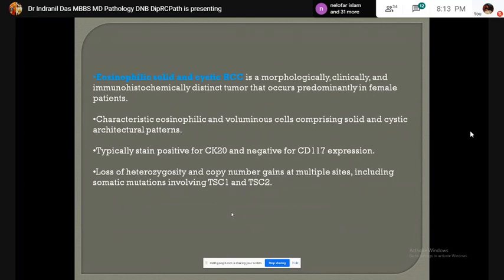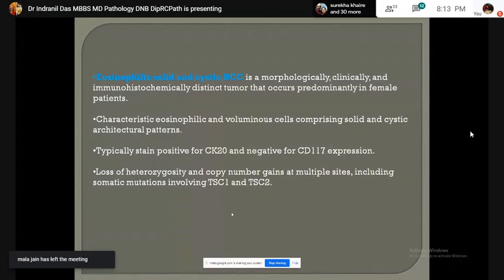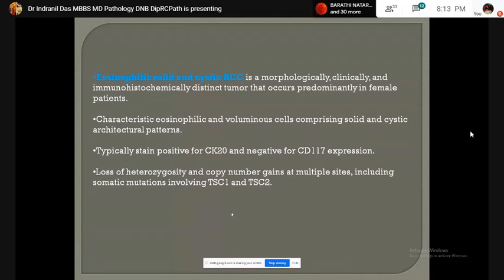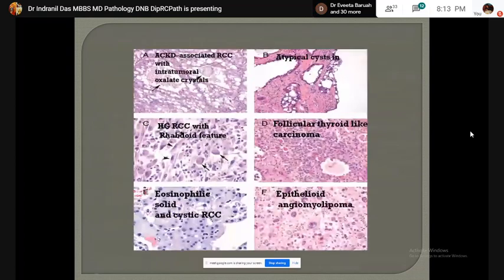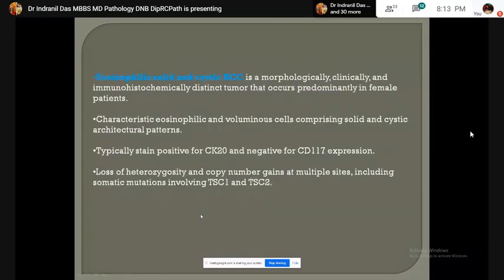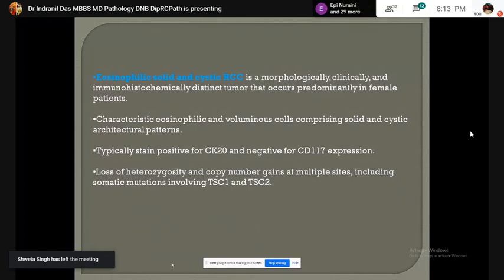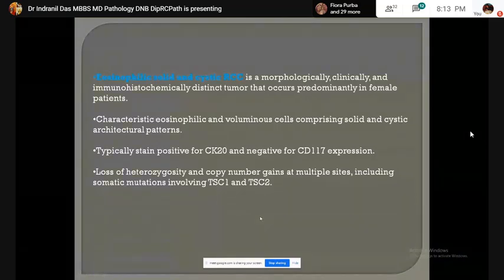A new entity is eosinophilic solid and cystic renal cell carcinoma — a morphologically and immunohistochemically distinct tumor. Characteristic eosinophilic cells with voluminous cytoplasm comprising solid and cystic areas are seen. This tumor stains positive for CK20 and is CD117 negative. Somatic mutations involving tuberous sclerosis genes TSC1 and TSC2 have been noted in this tumor.